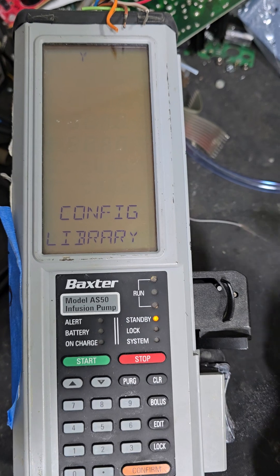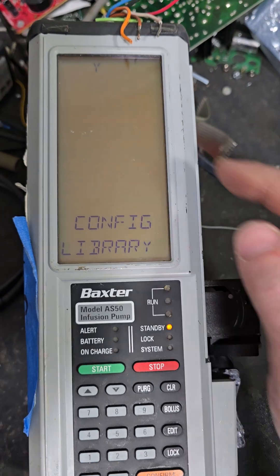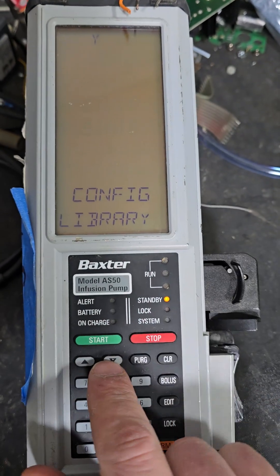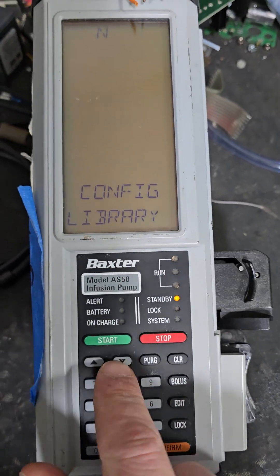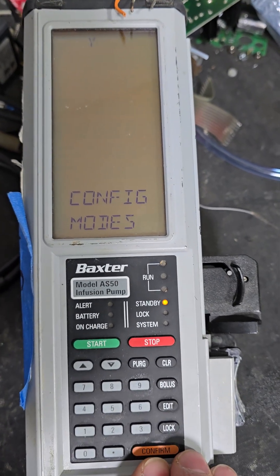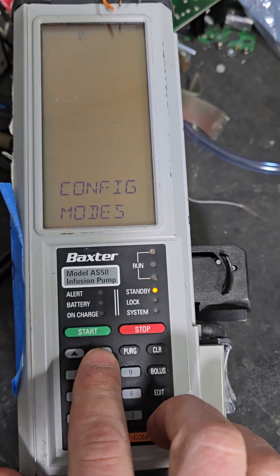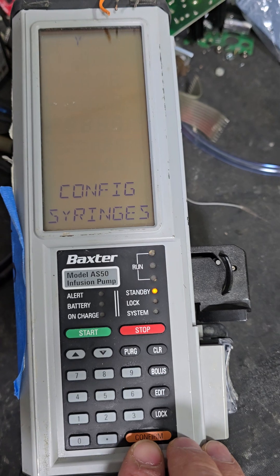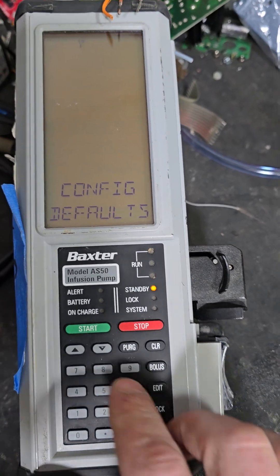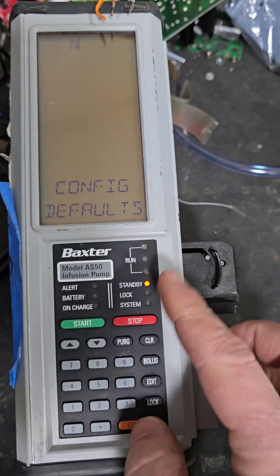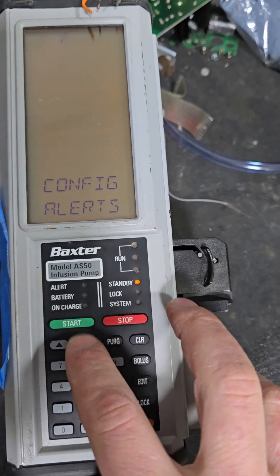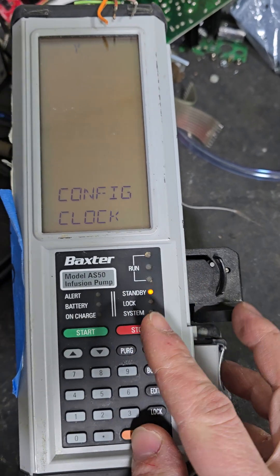Configure the library. If you want to configure the library, hit confirm. Otherwise, see where it says Y up there? Use the arrow to select no, hit confirm. You just keep doing that until you get to the setting you want to change — no, no, no, no.